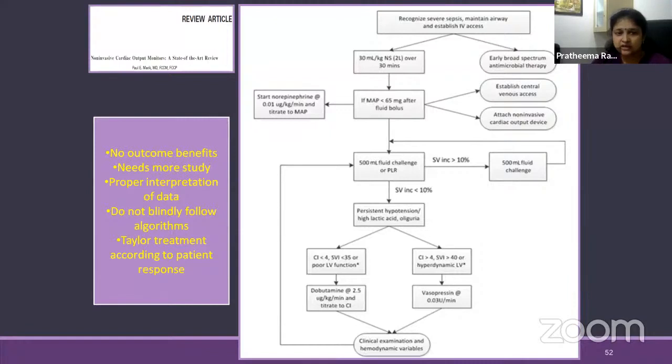They are not totally, like, put on autopilot mode, thinking that non-invasive is good. But in OTs, where the patient is going for a high-risk surgery and is not very sick preoperatively, the surgeons are very happy if the anesthetists use the non-invasive methods.